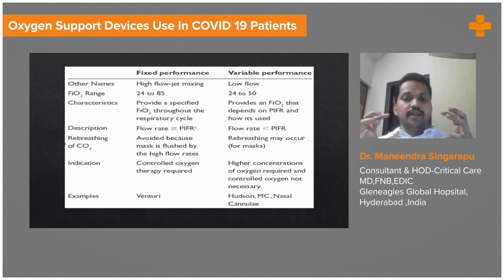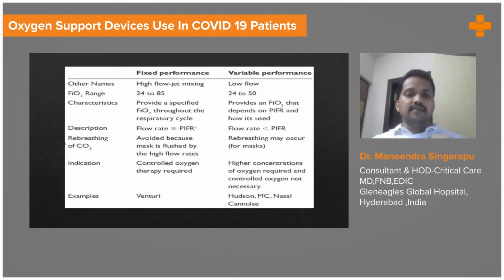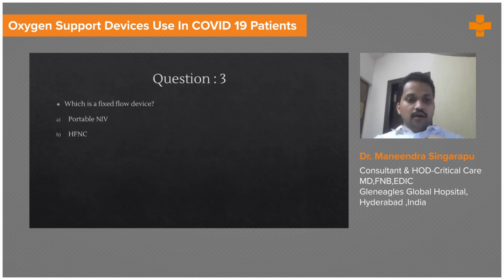is a principle wherein the energy is constant. Whenever your kinetic energy decreases, the total energy will be constant, as a result of which a fixed FiO2 will be given to the patient. So the Bernoulli's principle is the principle on which the fixed performance devices work, and this principle is there even in the suction devices which are there. Okay, so now I'll be coming to my topic.